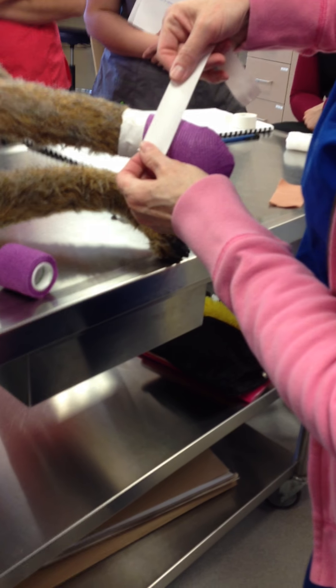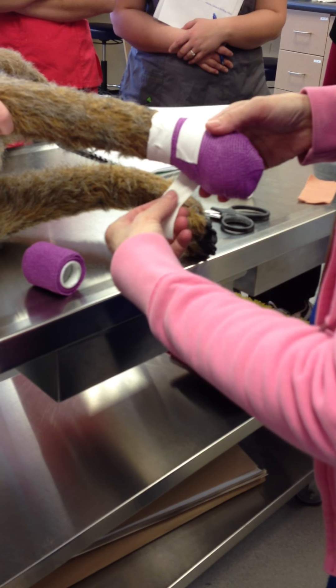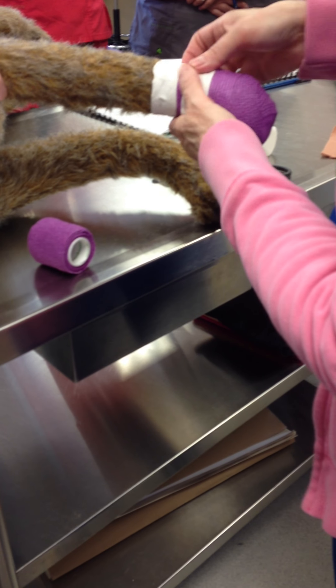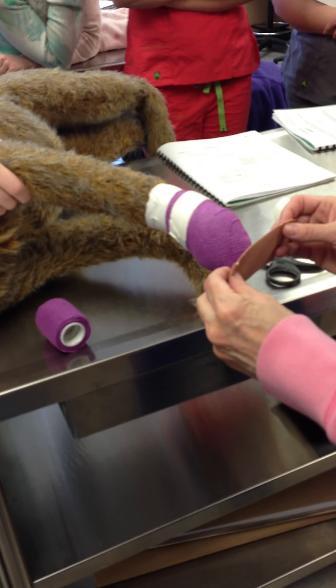As long as it goes around, it comes back on itself. That's good. Lovely — he's going home. So I see they're going to reinforce the sole, and I think that's a fantastic idea.